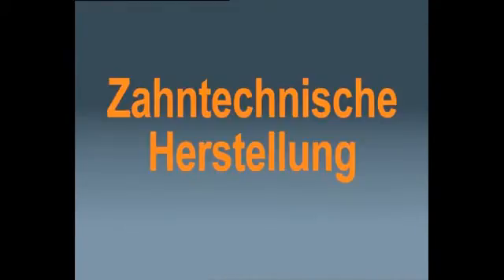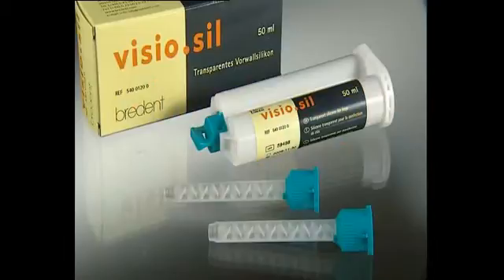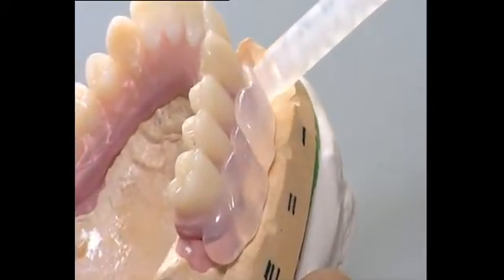Laboratory Fabrication. Visio-Sil, a transparent silicon, is used to fabricate an index for retaining the position of the veneers and transferring the setup to the permanent restoration at a later stage.